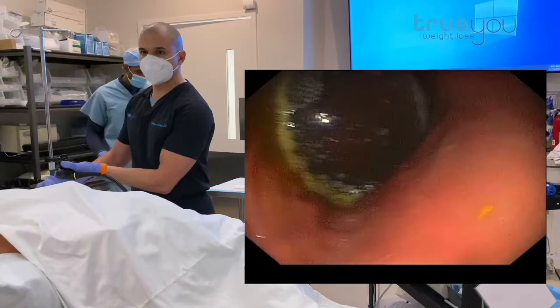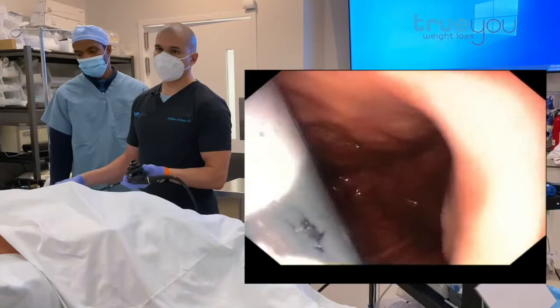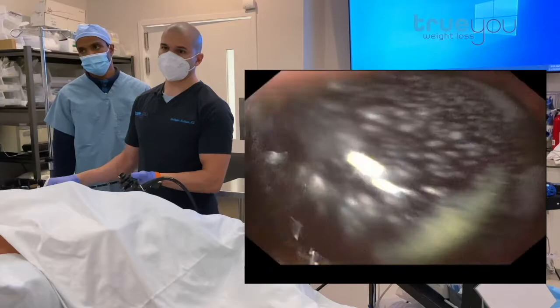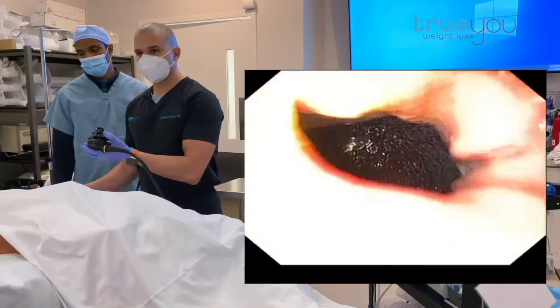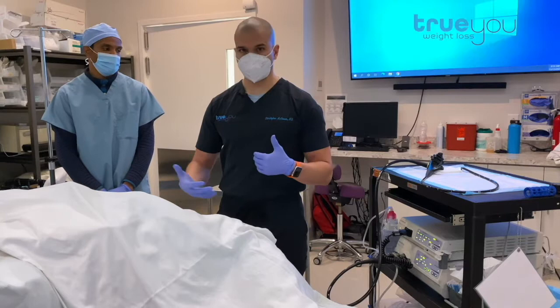Our patient will go about her normal activities — exercise, travel, whatever she likes to do — for the next six months. She will follow a liquid diet for the next three days of clear liquids, then two weeks of full liquids which is protein shakes. That gives the stomach time to get used to the balloon, then she'll advance to regular food. She'll wake up momentarily and go home. This is a 12-month program: the balloon stays in for six months, then we reverse the process and remove it. For 12 months she'll work with our team and dietician to stay on track with nutrition and losing weight appropriately. That is the Orbera balloon placement.